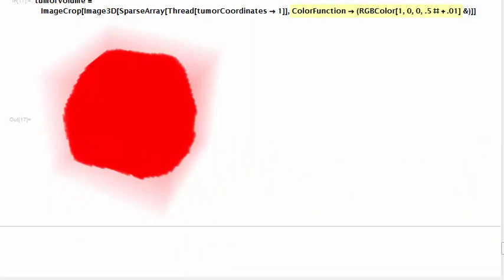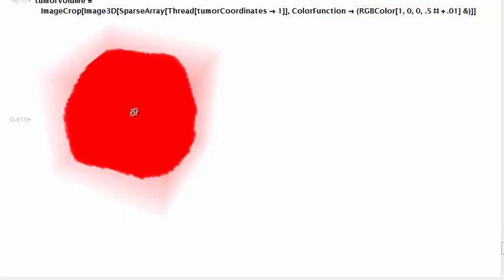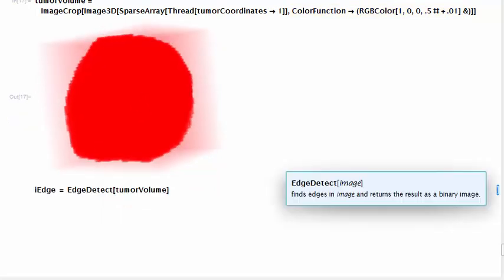In order to perform box counting, we need to ignore the internal mass of the tumor. We only need its shell, its surface, and to get this we call edge detect on the volume.